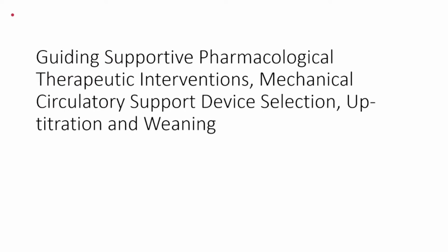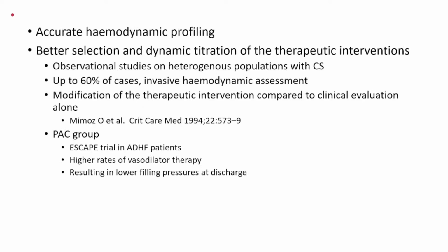Then Swan-Ganz can help us to guide the pharmacological intervention and mechanical circulatory support. I mean, it can help us to choose which mechanical circulatory device, whether to increase the support or to wean it. The accurate hemodynamic profiling can help us in better selection and dynamic titration of therapeutic interventions.